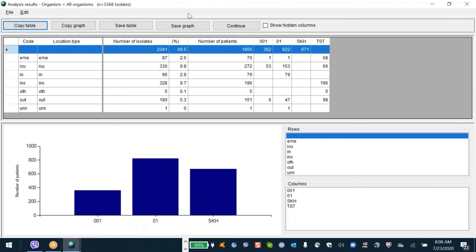I can see hospital 001 and SKH don't enter that, which is unfortunate. We don't know if it's an inpatient or an outpatient. I think you put that information into department. So it's not that it's not there, but it's there in a way different from the other hospitals. Meaning it's more awkward to integrate the data. So we'd like to standardize where people put the information so we can facilitate the analysis.